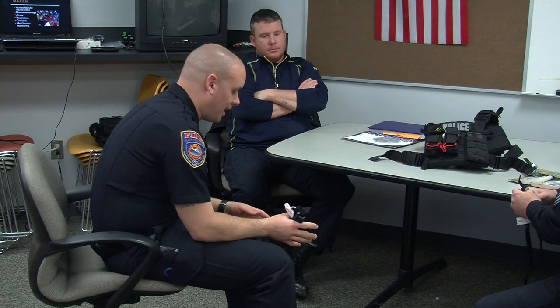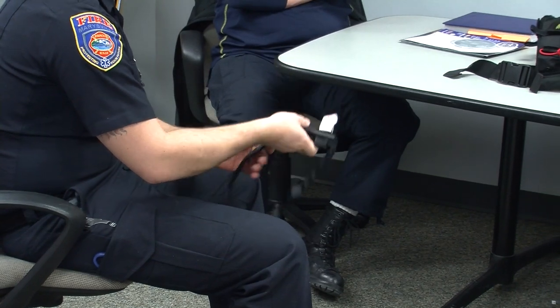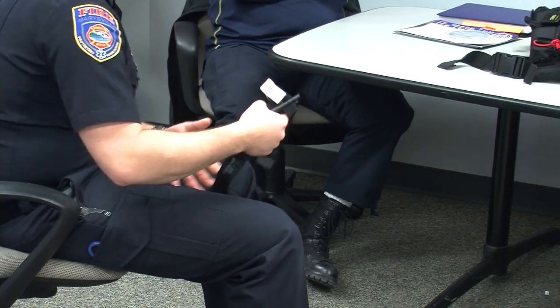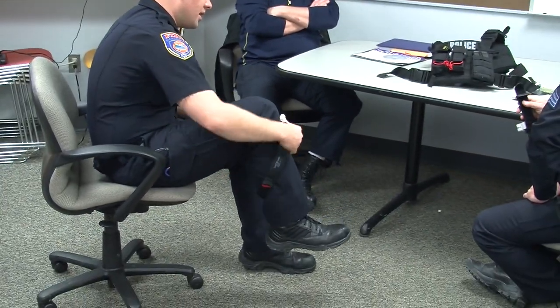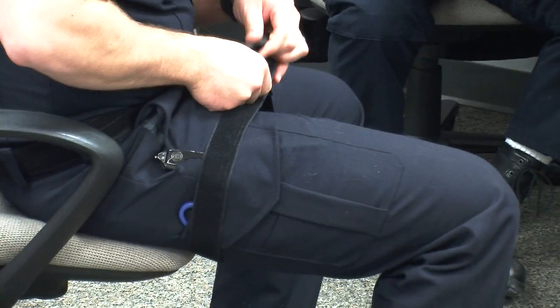When you're putting it on your leg, same thing. The general rule of thumb is if I'm using one hand to put this on, I only go through one loop on the buckle. If I'm using two hands to put this on somebody else's arm or on my leg, I have to go through both loops of the buckle. When you put this on, you can leave it in a loop or you can undo it completely. And the same thing, it has to be up as high as you can get it.